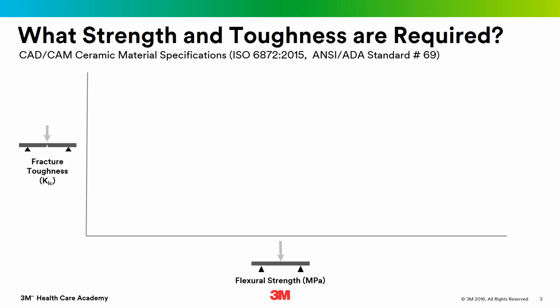As an example, materials such as glass, which break easily when scratched, have a relatively low fracture toughness, which can be undesirable when used in many dental applications.